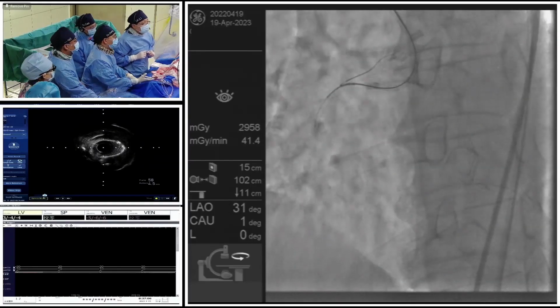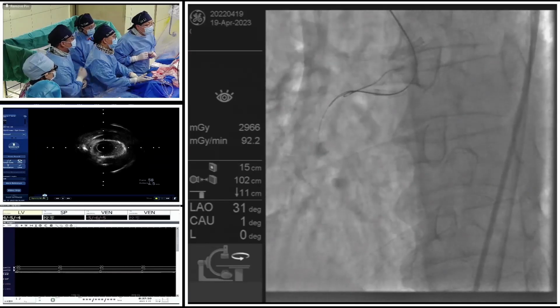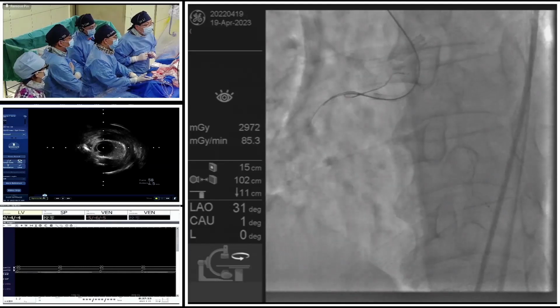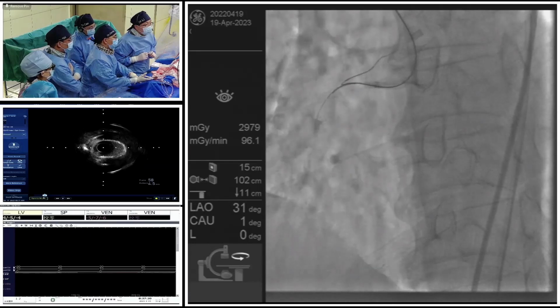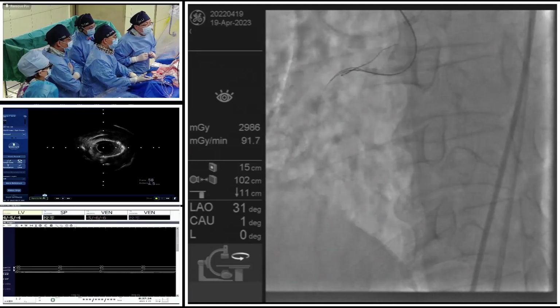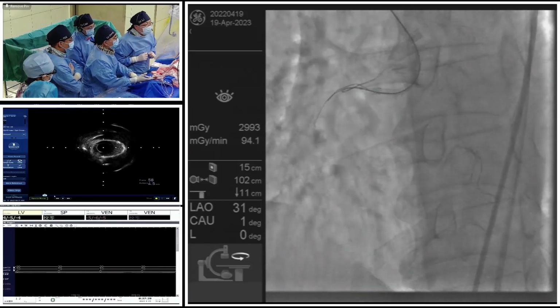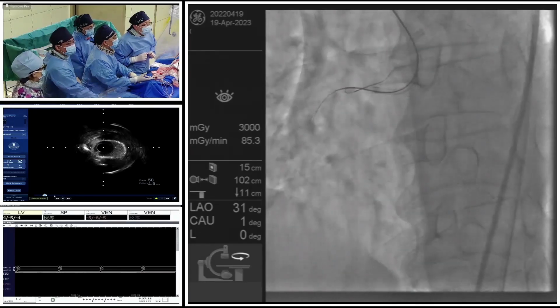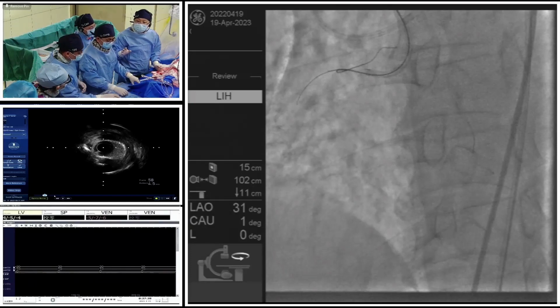For this case, we chose the bifemoral approach because the radial artery would be used again. The patient also has a stent in the iliac artery. So the patient has very severe atherosclerotic plaque. I think I should choose another, relatively stronger wire, CP again.